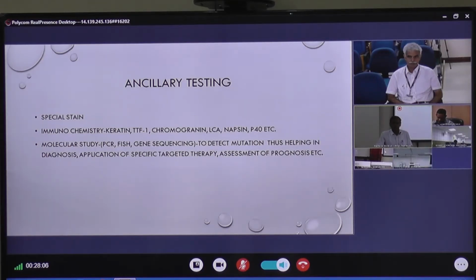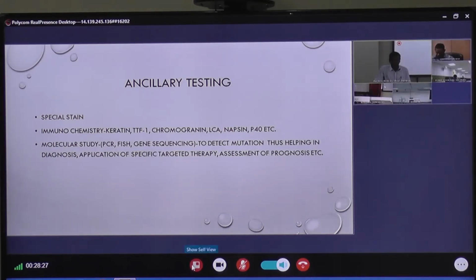And also the ALK, if we consider adenocarcinoma of lung, then we can see that ALK protein or the product of ROS1 gene rearrangement, all these proteins or molecules can be successfully detected by IHC. Thus, IHC has become the first line of test for detection of these molecules because of its cost effectiveness, high sensitivity and high specificity.